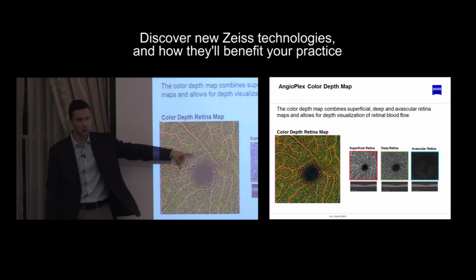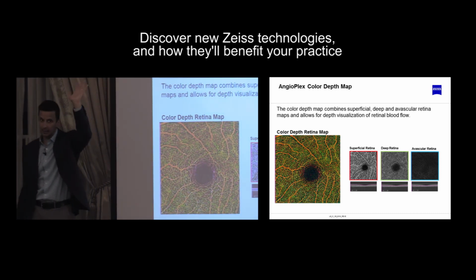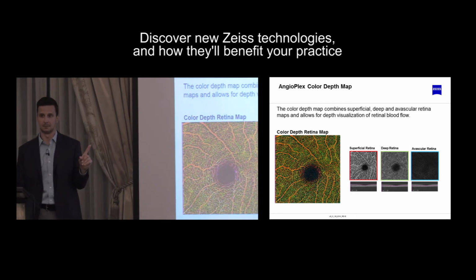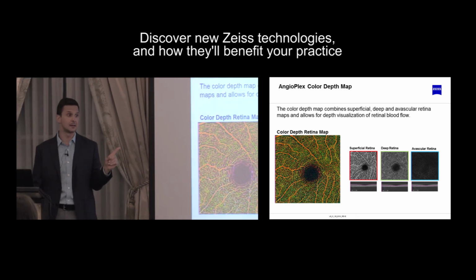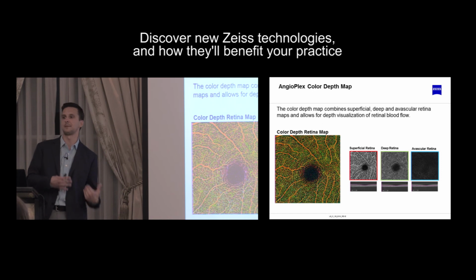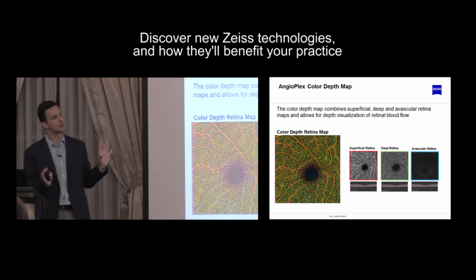So if you saw blue in here, it's a, hey, watch out for what you're seeing. It doesn't mean they have something. There can be another reason why blood vessels are in the avascular zone, and it's not anything to do with new blood vessel growth in the avascular zone. It can be due to structural changes, due to stuff happening underneath or up above, so be aware of that.